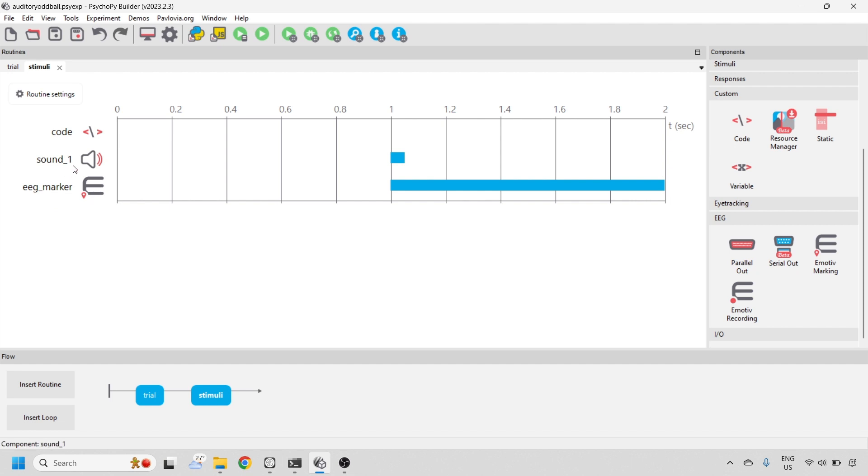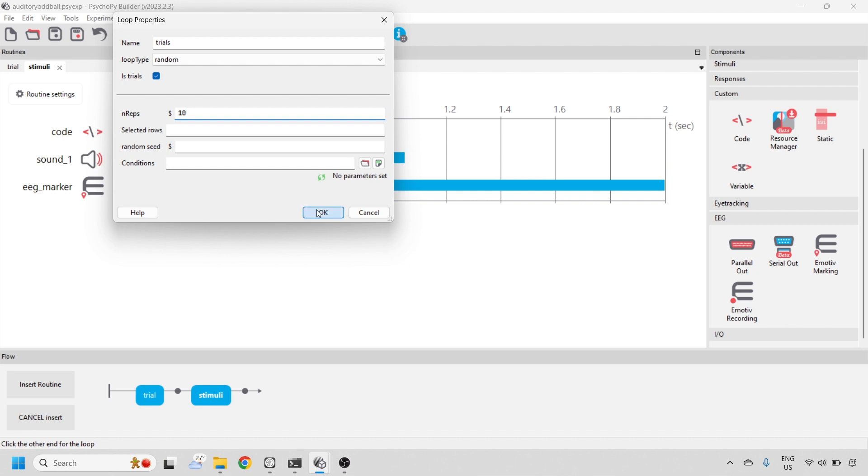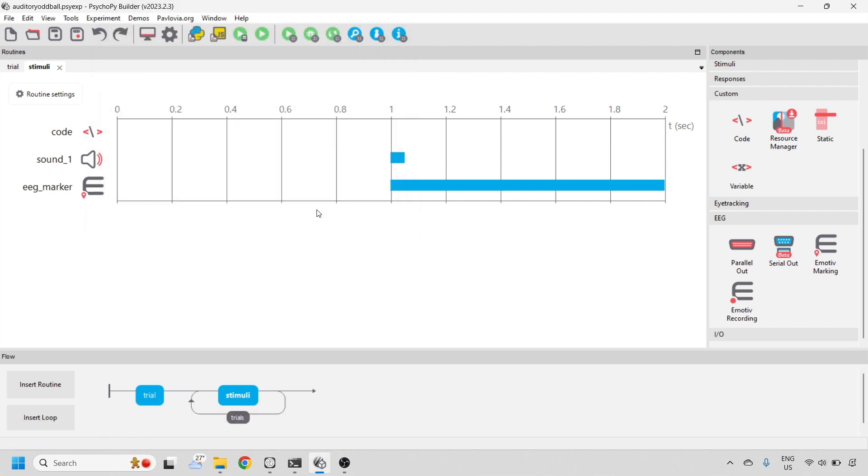This will only deliver one tone, so we want to add a loop so that we can deliver more than one tone. We can change this up to 300. The more trials, the better. I'll leave it at 10 for now, just for practice.